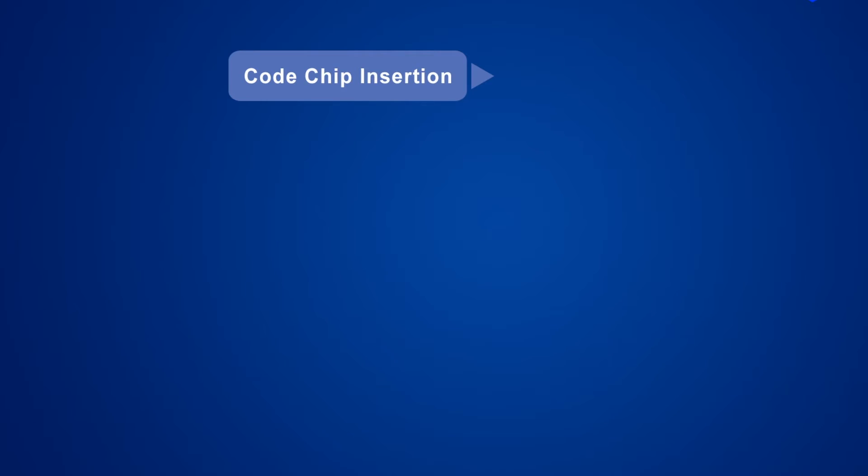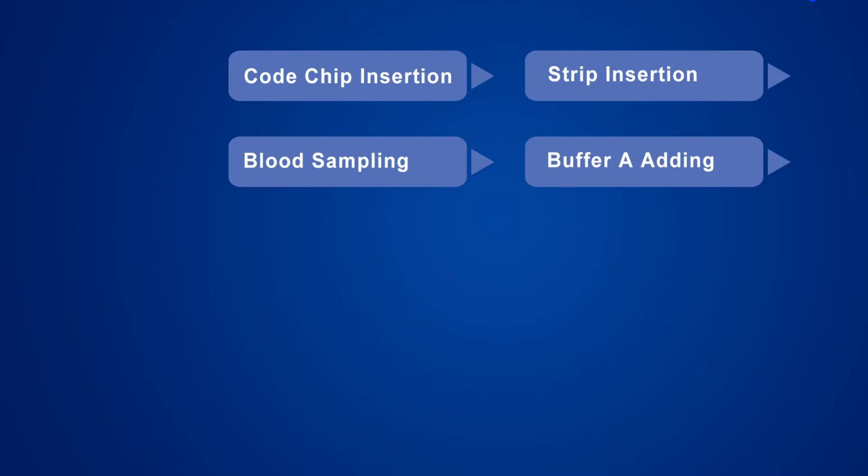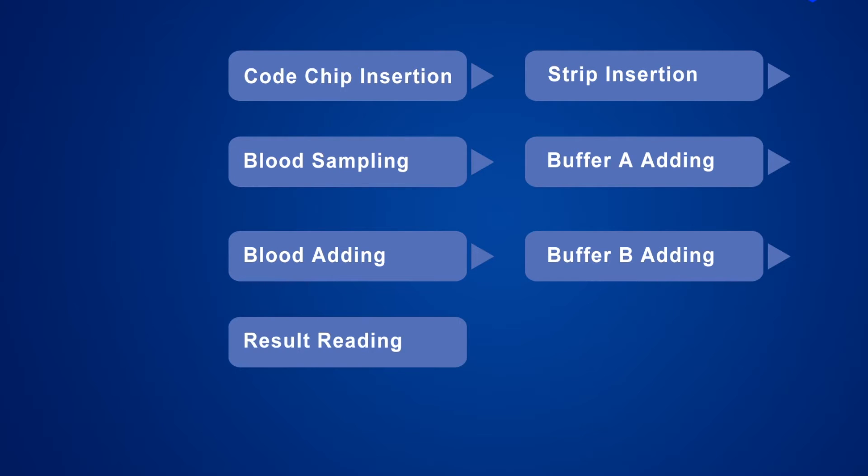Testing Procedure. The testing procedure consists of: code chip insertion, strip insertion, blood sampling, buffer A adding, blood adding, buffer B adding, and result reading.